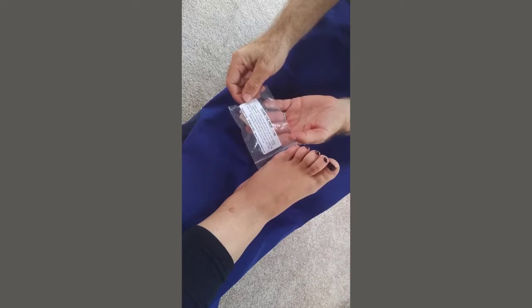Basically, you loosen the elastic strap and place it over the toe with foam padding underneath. Pull the loose end of the elastic but do not over tighten. Cut off any excess elastic but leave some spare.